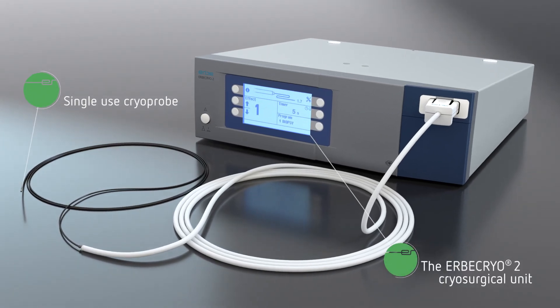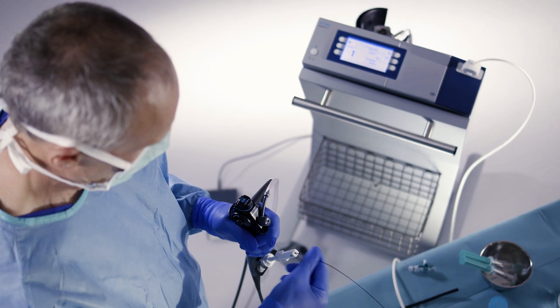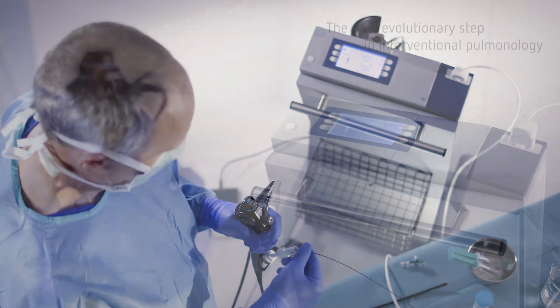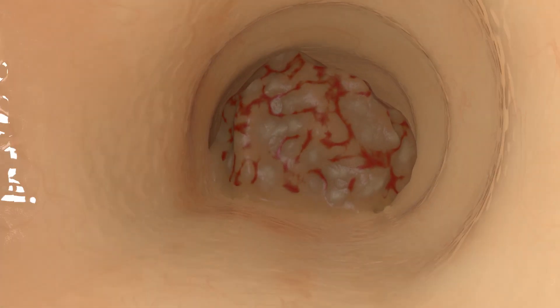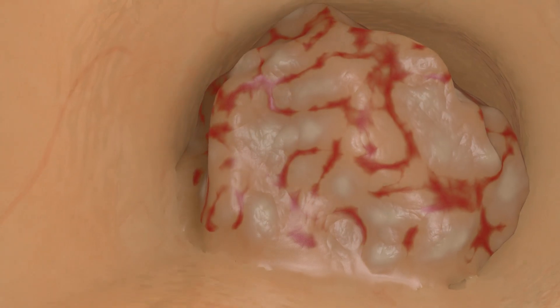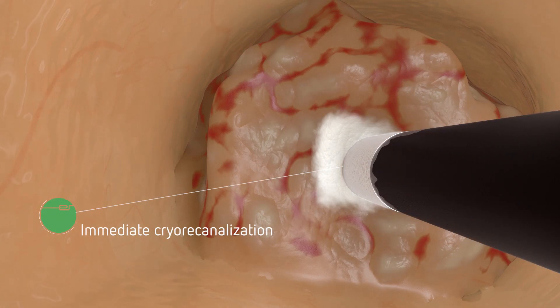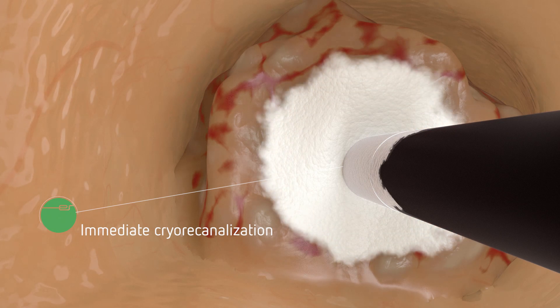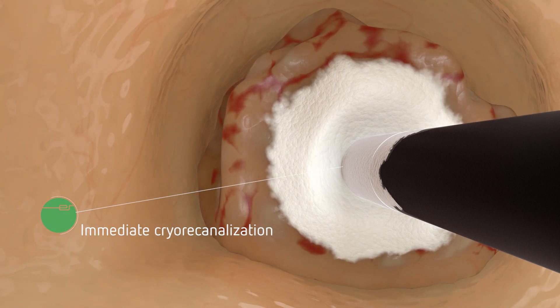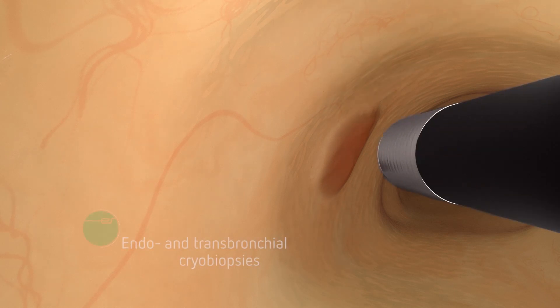Flexible cryosurgery continues to evolve as a leading modality in therapeutic and diagnostic applications in pulmonology. For example, flexible cryoprobes are routinely used to immediately re-canalize stenosis in the tracheobronchial tract, or to extract biopsies of superior quality.